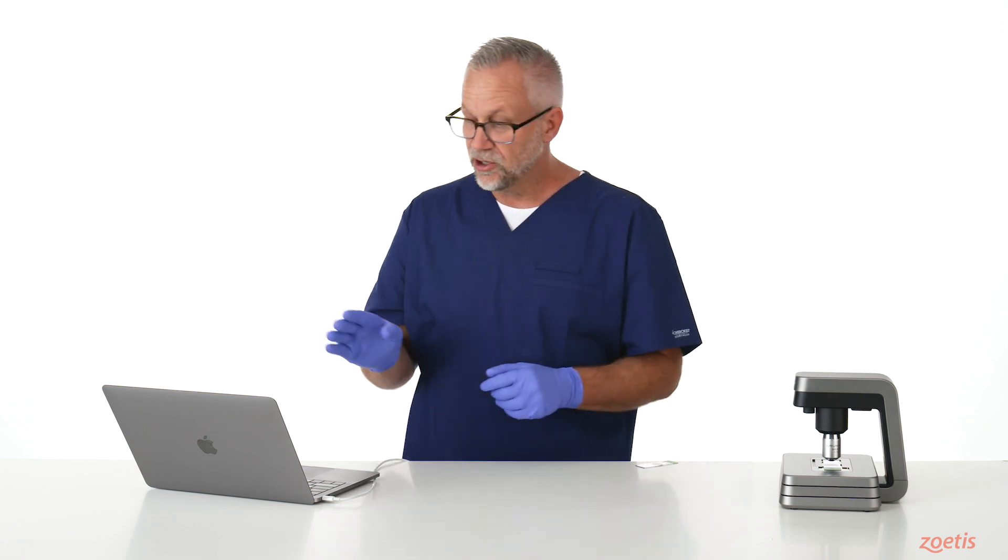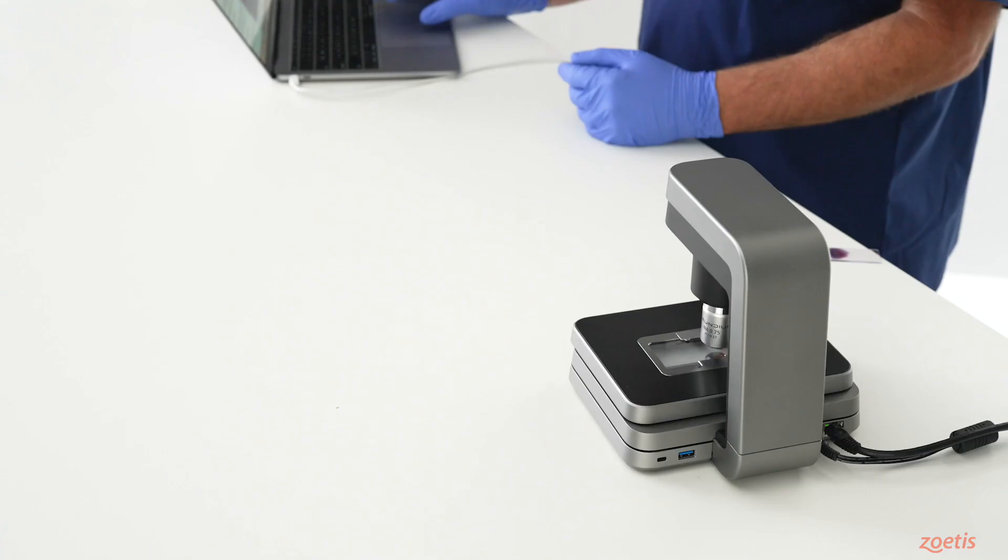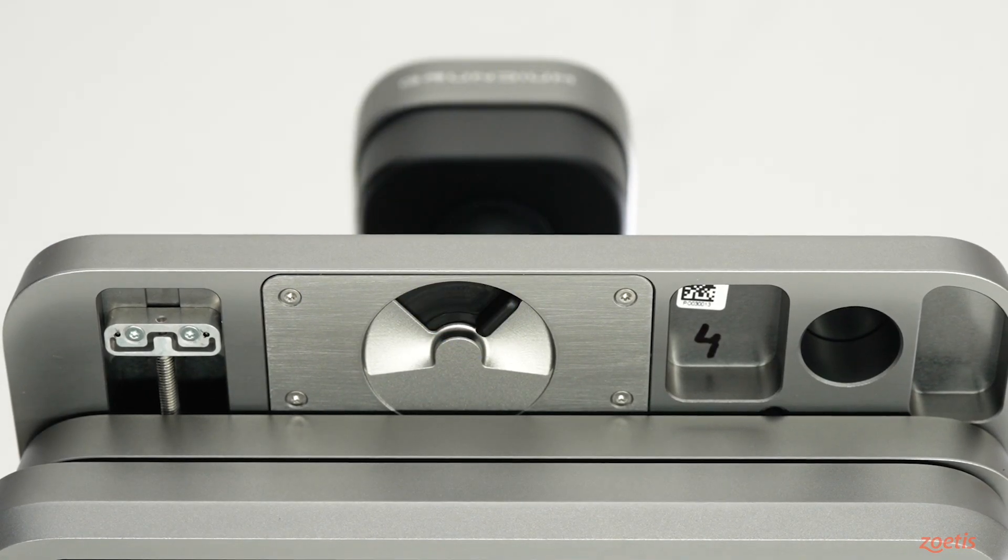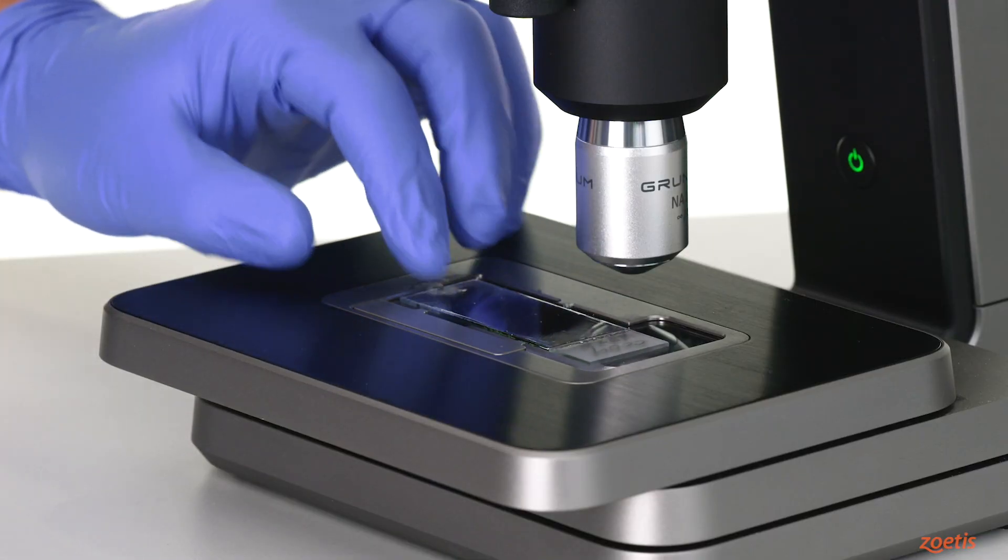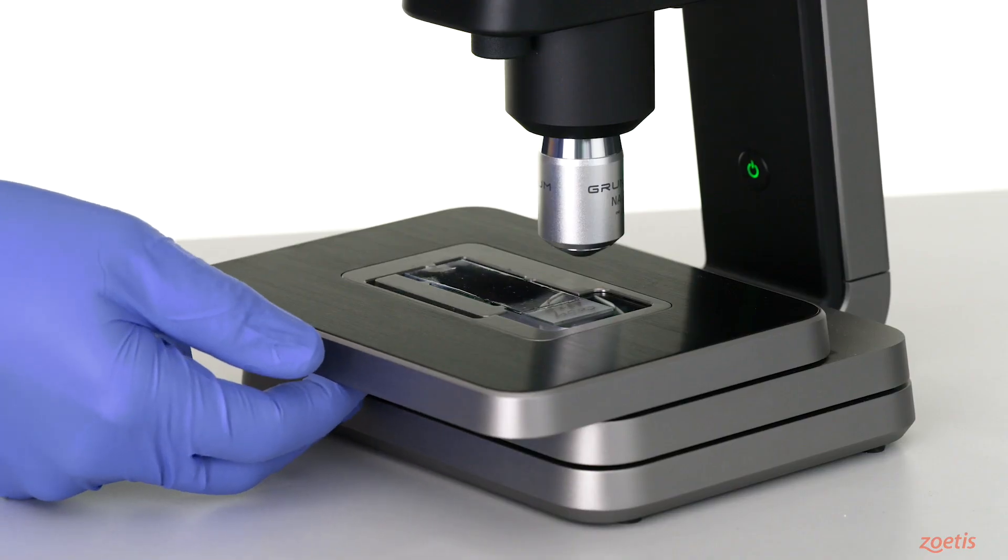If it's closed, you can return to VetScan Images and click on the Open Tray button. With the locking mechanism open, place the slide with the label towards the right of the stage and make sure that it's face up on the stage, and then close the locking mechanism.